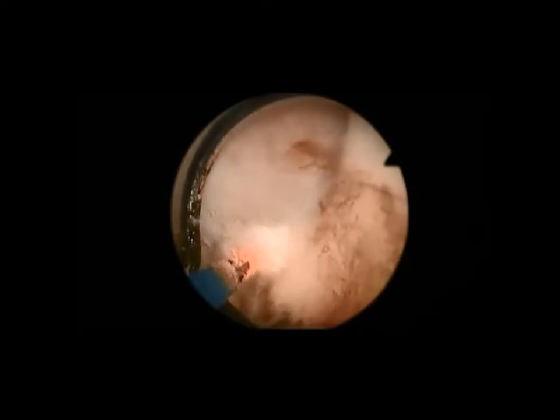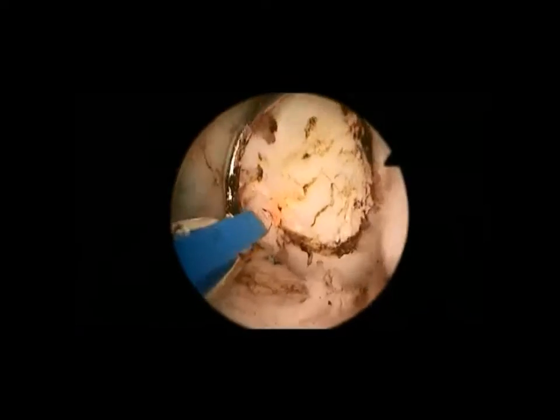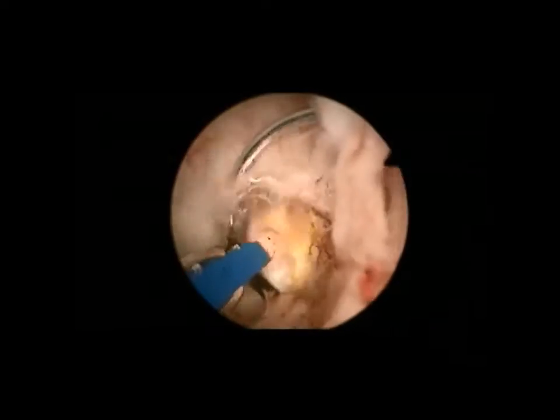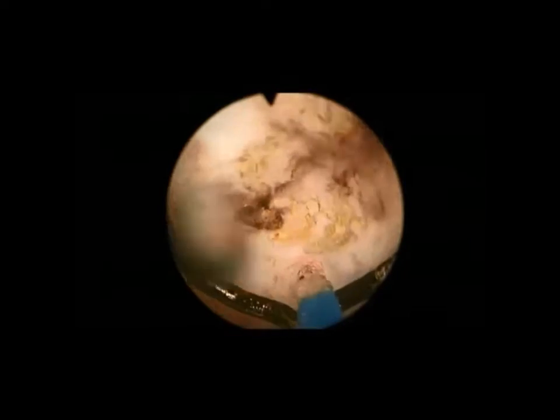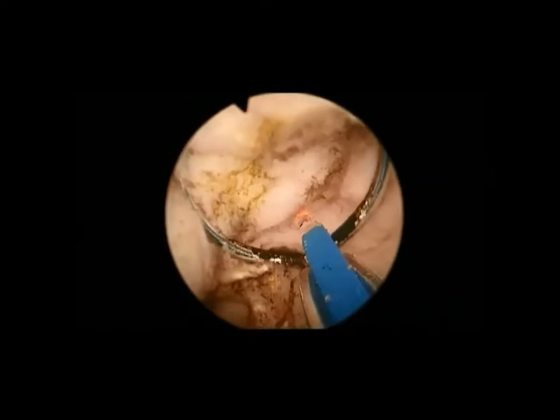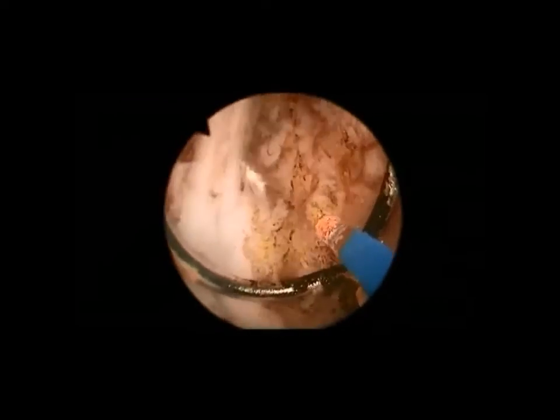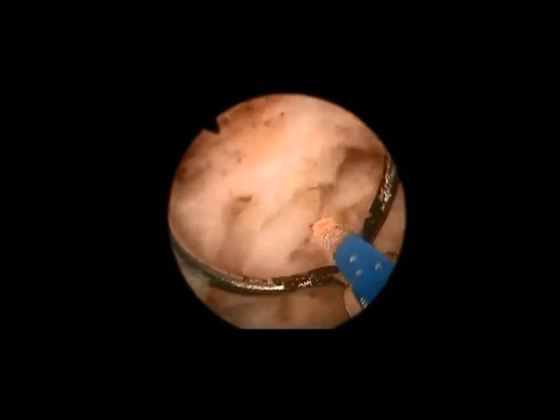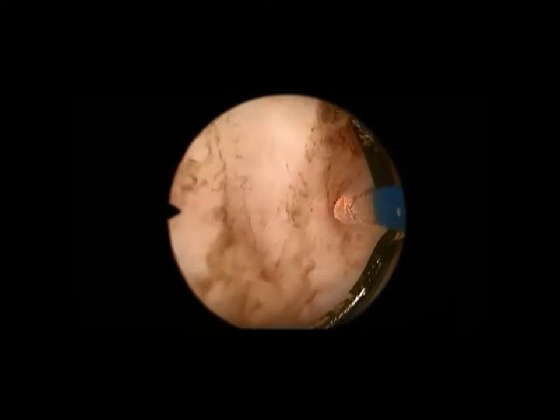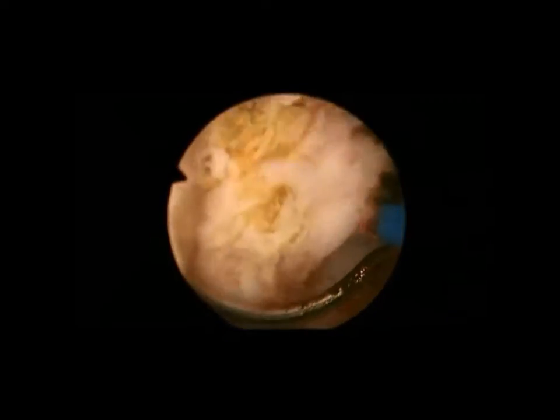Once the right lateral lobe has been completed and released, we will move to the left lateral lobe and perform the same dissection. We work from lateral to medial and then retrograde, and then complete the 5 o'clock incision, working medial to lateral until we release that BPH adenoma. The lateral lobes are attached, so once the second lateral lobe has been enucleated, the attached bilateral adenoma should go into the bladder.